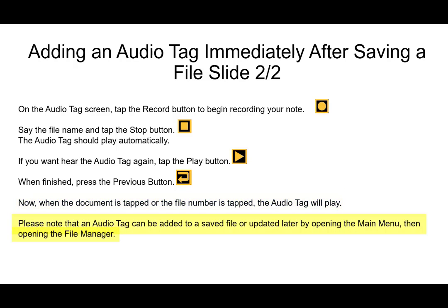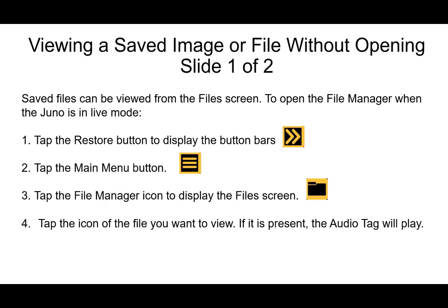Please note that an audio tag can be added later to a saved file or updated within the file manager, and we will talk about how to do that. You can view a saved image or file without actually opening it.